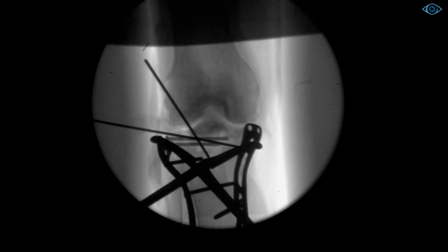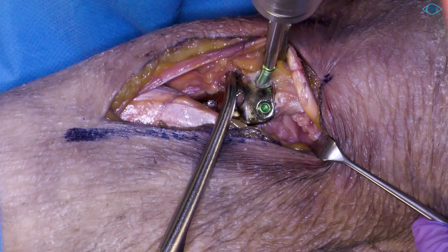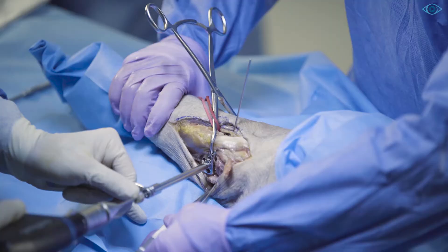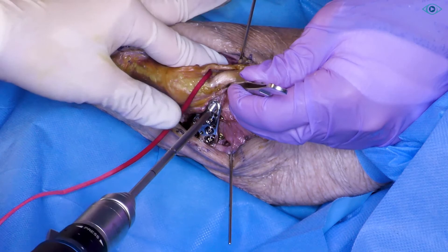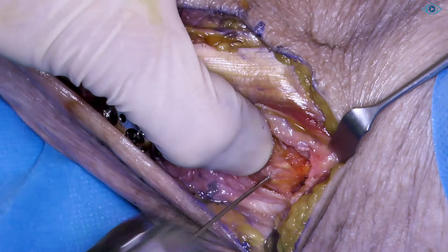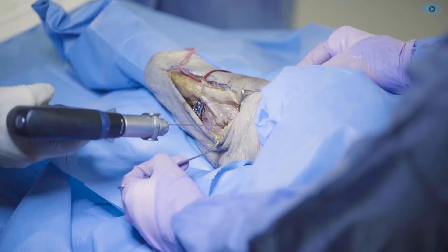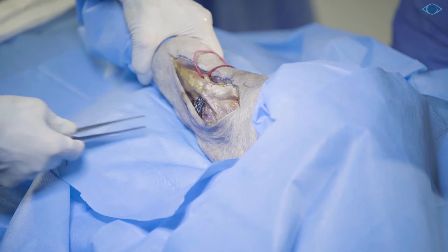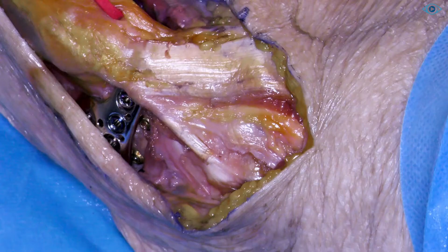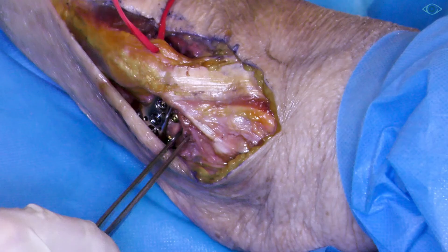So we have repositioned the tibial head quite well, and now we are going to fixate it. We use locking screws to assure optimal stability in this massively osteoporotic bone. Then we fix the lateral epicondyle here with these two tension screws, and finally the knee is stable again. This is the lateral collateral band, which is fixed again so that the tibial plateau does not move here anymore. Before, you saw how far we could open it up — this is not the case anymore. The joint is very stable again and you can hardly see into the joint surface, which has been raised and repositioned very well here. Now we're going to do a final x-ray, and then we're done.